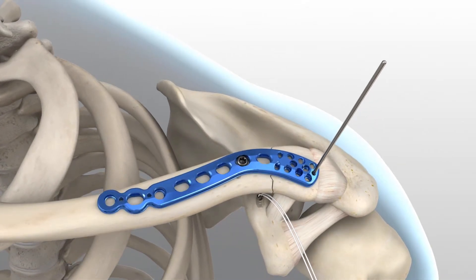Based on the number of anchors, be sure to leave one or two of the compression slots located above the coracoid empty to allow for insertion of the suture retainers. When drilling the screw holes, use precaution to protect the suture from the drill bit.